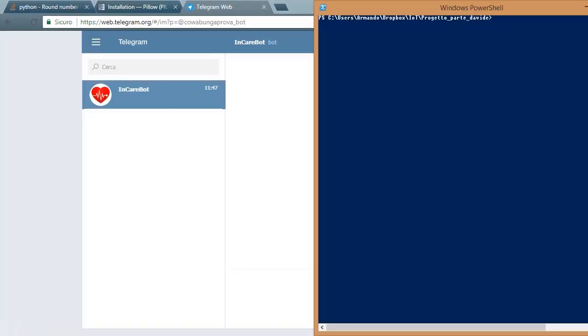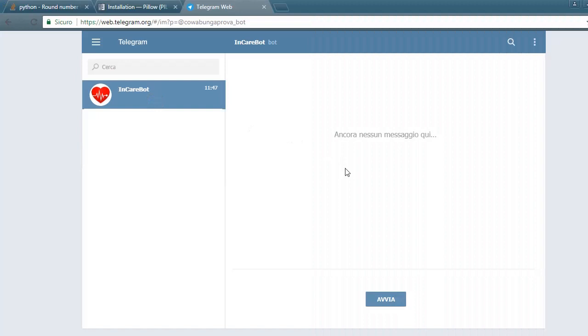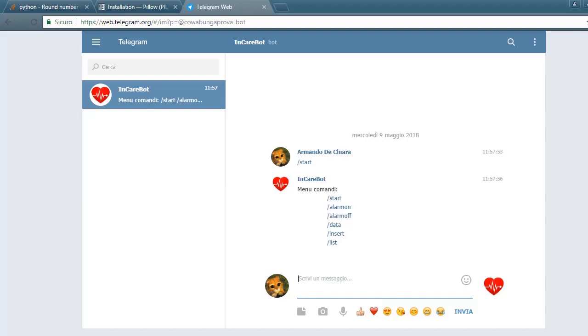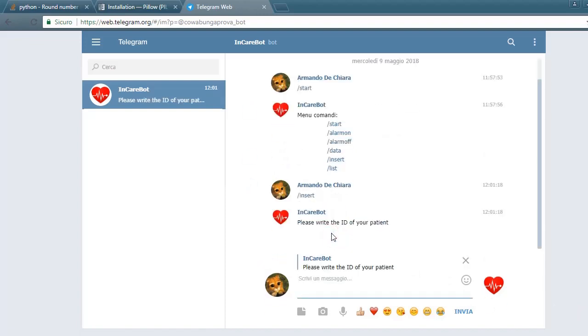From the terminal we can run the bot and now we can use the application. The command start runs the bot and automatically the doctor is added in the user list of the catalog, if not already present. From the InCare bot it is possible to add patients to the user list in the catalog. We press the command insert that allows this feature and we type the patient ID, for now Polito.